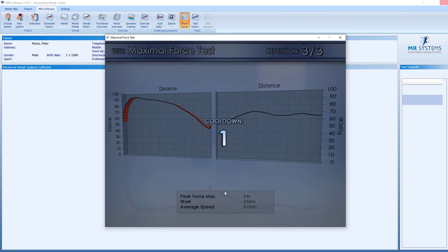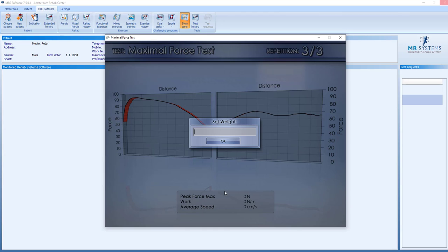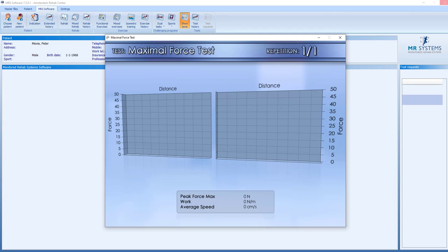We did the trial repetitions. We got the cooldown and we now have to set the weight. We select the weight and we set the weight at 20. That means 20 kilos at the machine.